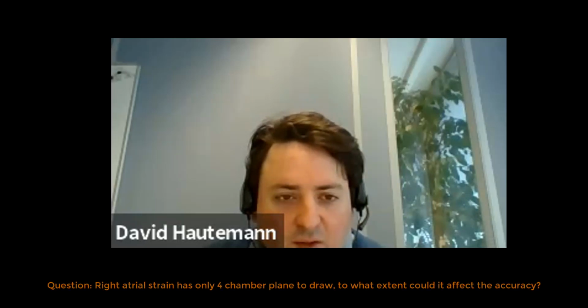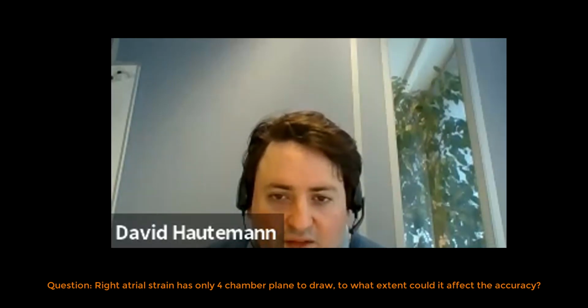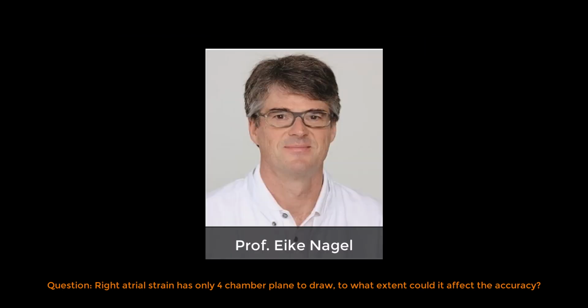Now the final question that we had was about right atrial strain. If you would only draw it in a 4-chamber view, to what extent could that affect the accuracy of the measurement? You can use several long-axis views to determine right atrial strain, and that is more robust than using just a 4-chamber plane. The main reason is that in principle 3D is always more robust than just using 2D.